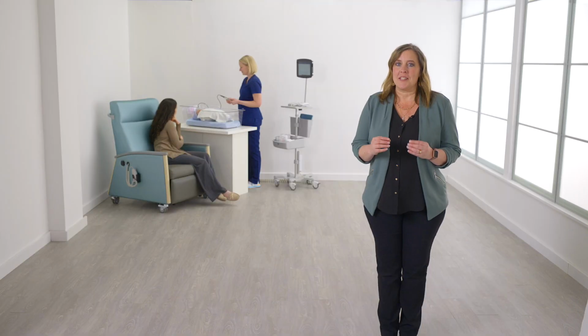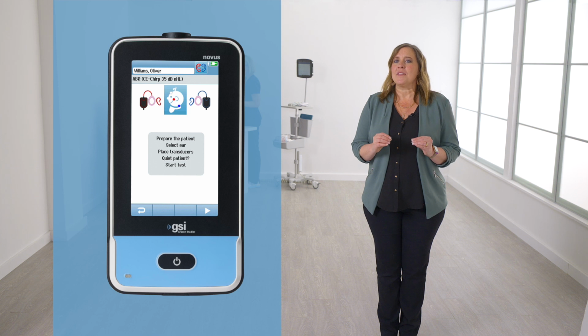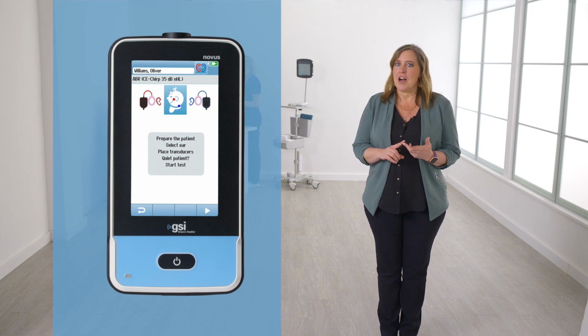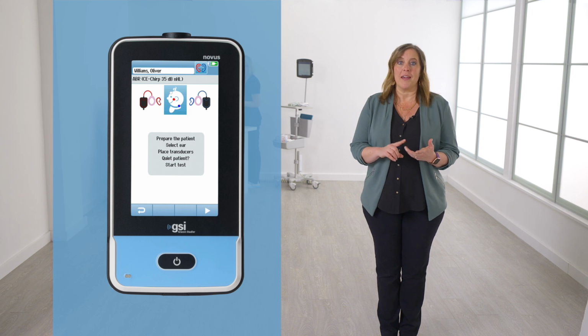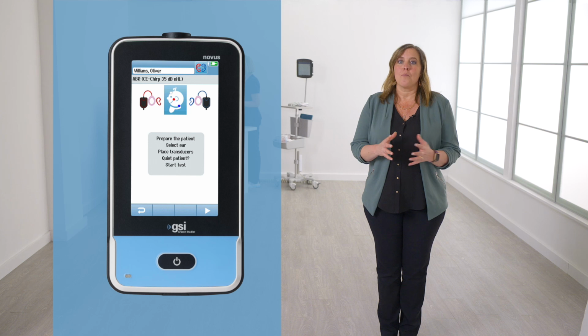Once the patient name is selected, the initial test prep screen will appear. Take a couple of seconds to verify the patient's name, ensure that the transducer icons match the transducers you are using, and that the appropriate ear or ears are selected. Then, press the Start button to begin the impedance check.